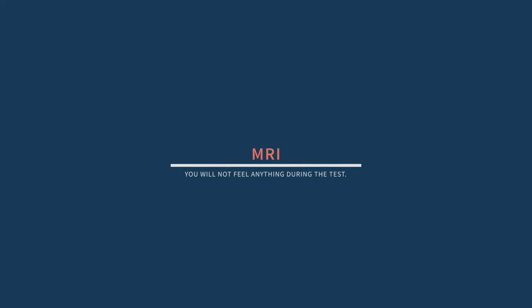You will not feel anything during the test. The machine may make some tapping, thumping, and clicking sounds. Those noises usually sound something like this.